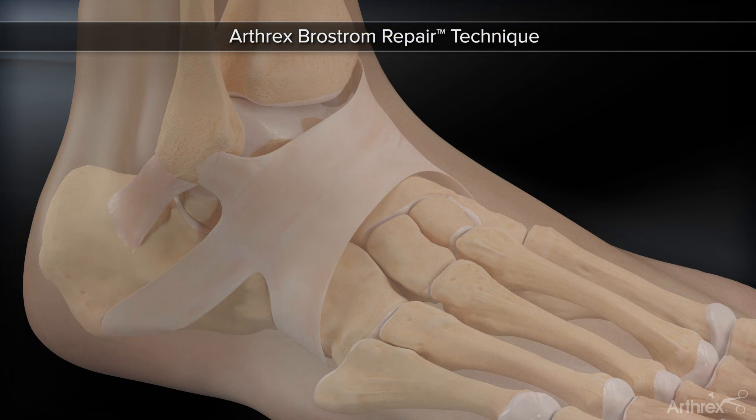Arthrex presents the Arthrex Brostrom Repair Implant System. This system allows surgeons to perform a modified Brostrom Gould procedure utilizing a singular miniature incision.